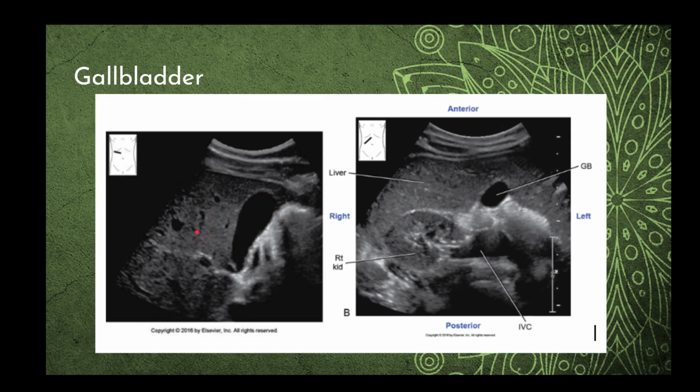Here again we have the liver. This portion here is the duodenum, and the duodenum sits right next to the gallbladder. And this gets kind of tricky because gallbladder stones can hang out on this side, and so now we're wondering, are these shadows from the duodenum or are these shadows from something that's in the gallbladder? This ends up being a pitfall of how these are related to one another, but that's why we roll the patient and make sure we look at things in multiple views.